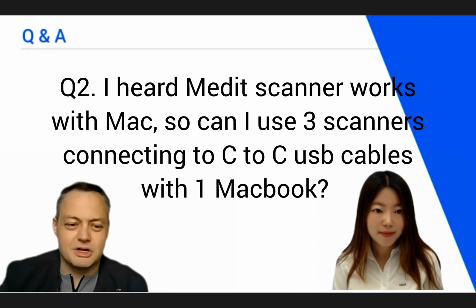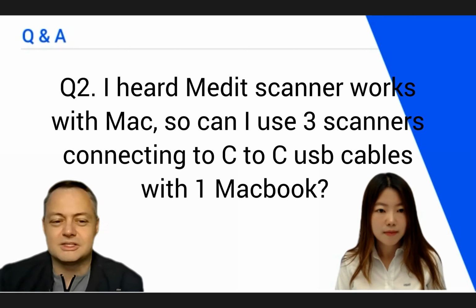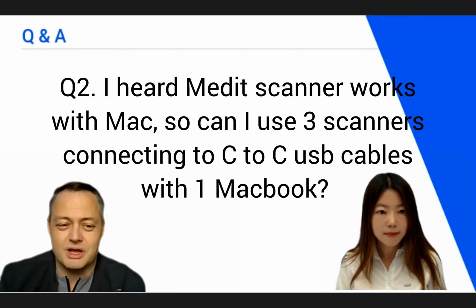You can use multiple scanners with your MacBook. The idea is you have one screen and multiple scanners. You just have to transport your MacBook from one operatory to the next, where everything is set up and you can start scanning again. The scanning experience, as we talked about in the first webinar, is really great on Macs. They have good runtime on their batteries with stable FPS, with a stable software experience. So yes, MacBooks are a good option for your scanning.